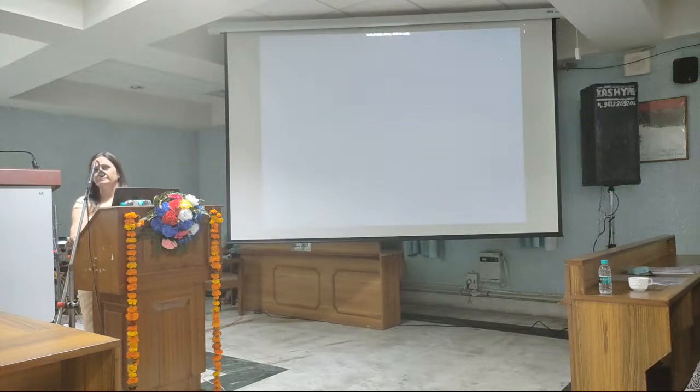Okay, thank you. The second query is, do you think that imaging is required before doing the biopsy with the probe? Yes, if we have lymphoscintigraphy also with the peroperative gamma probe, that is the best situation, but this luxury may not be available to all people.